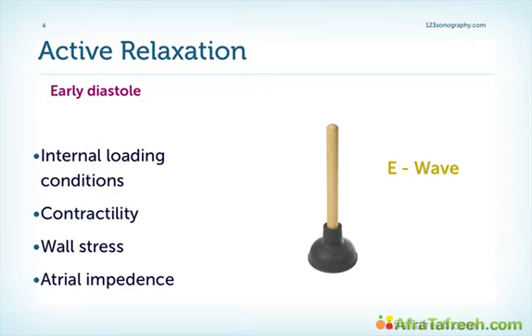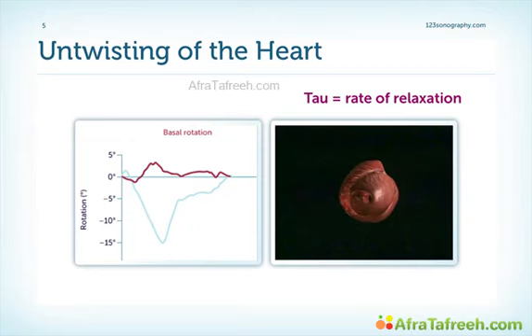Many factors play a role for early diastole: the internal loading conditions, contractility of the left ventricle, wall stress, and atrial impedance. To better understand early diastole, take a look at this animation.